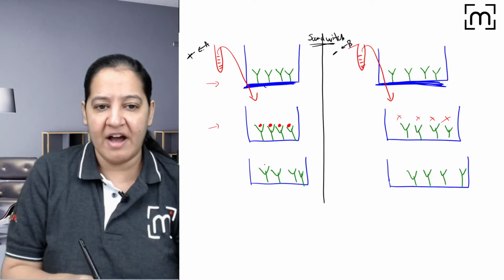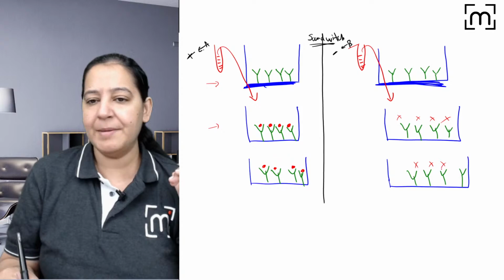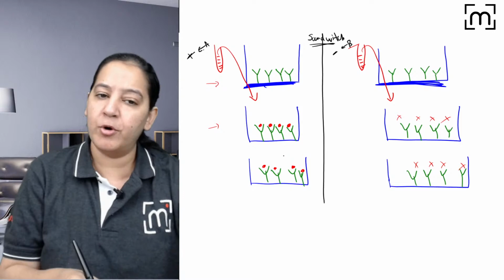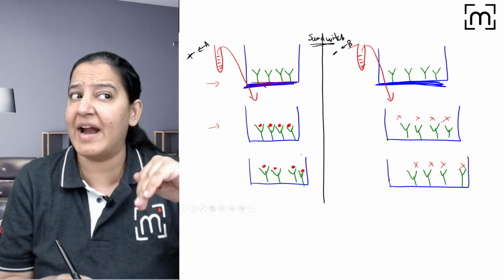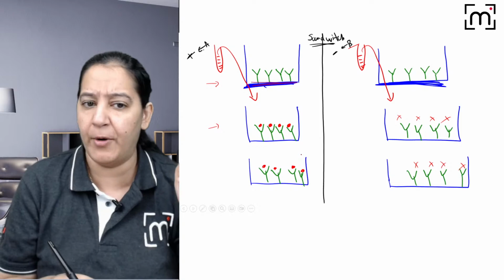You can see patient A, in which antigen antibody reaction is there. You can see patient B, no antigen antibody reaction is there. Now in step number three, you will put again an antibody against that antigen, available in the market. Like the starting point. In the starting point, what have you done? You have taken the antibody available in the market for that particular antigen you are suspecting. If you are suspecting HIV, take anti-HIV antibody from the market. But this time the antibody is enzyme linked. It is linked with enzyme.